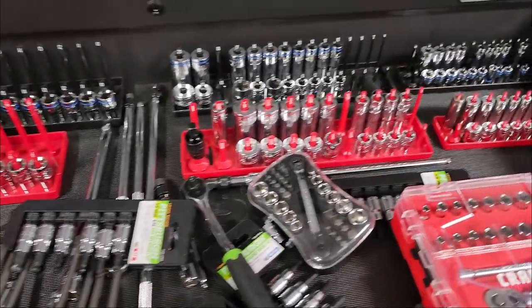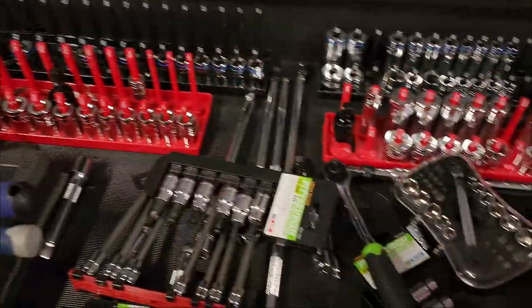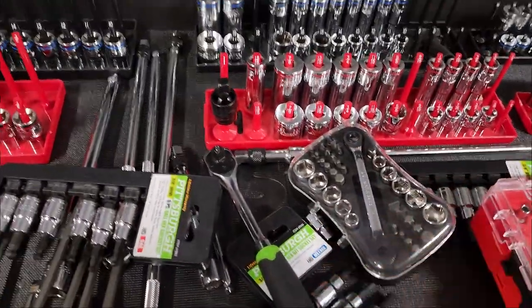Hey everyone, welcome back to Better Biomed. Today we are going to talk about sockets and ratchets — pretty much everything that works as a ratcheting device.